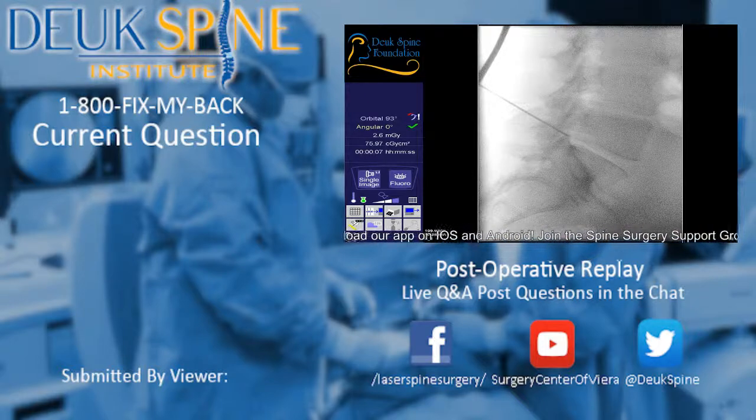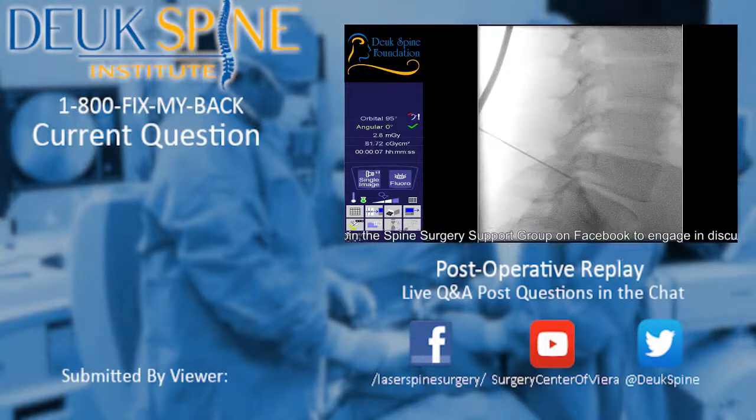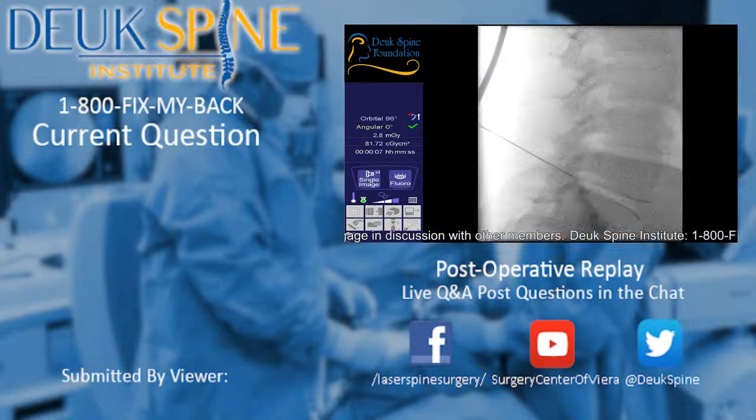Sometimes I'd say 50-50 on whether patients wake up in the recovery area and they know that their symptoms are gone. The other 50%, it takes them a few days to recover, and then they start feeling their symptoms are gone. So I don't know how our last patient will be, but it was the toughest case. And there was a lot of scar tissue as a result of multiple herniations, especially at L5-S1, that just socked in that disc herniation and held it up against the nerve root in the epidural space.